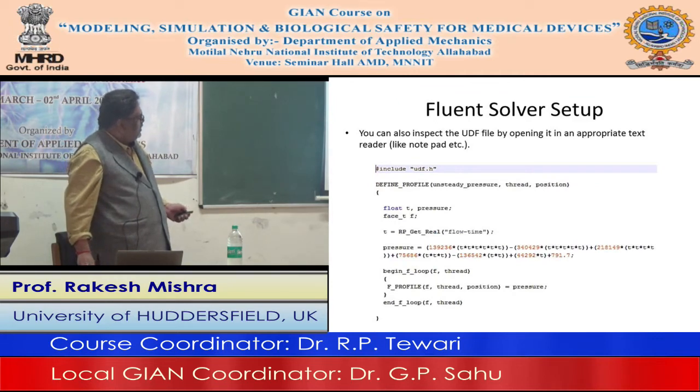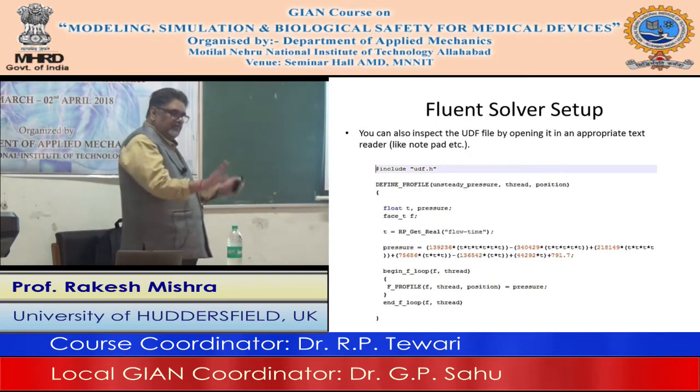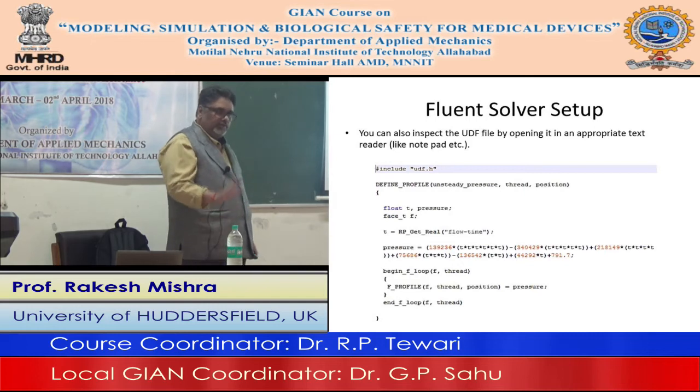And this is the curve, this is the cardiac cycle that we are trying to implement, the variation of static pressure in one pulse against time. So this is the equation that we have written, which is taken from this paper, numerical analysis of atherosclerosis and aneurysm in carotid bifurcation. So this has been taken from there. We write the equation, and then we can interpret it, and that is the only thing we have to do. Okay, that is the only thing we have to do.